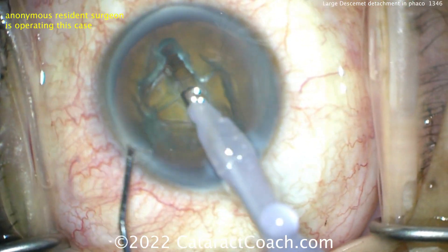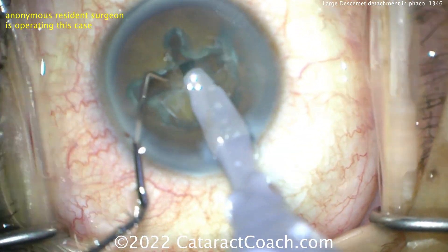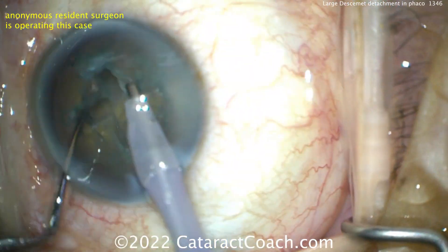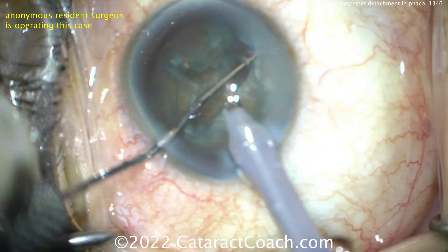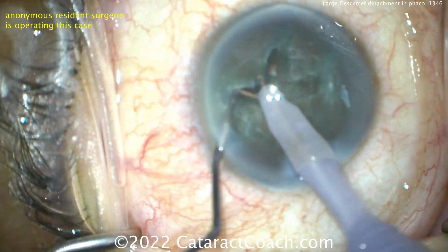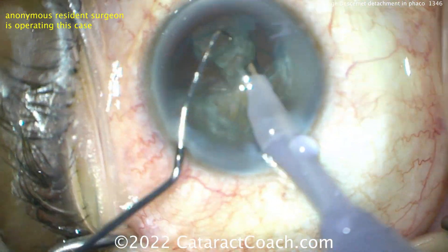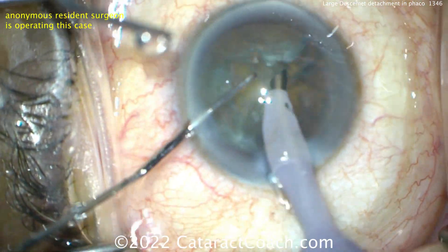Rotating — so divide and conquer. Very nice. Divide and conquer is a very reasonable technique for a resident who's done fewer than 100 cases. Splitting the nucleus here, and here, and there. Really good job. Bringing the pieces up and emulsifying them — going pretty well. The resident is doing a fantastic job here.